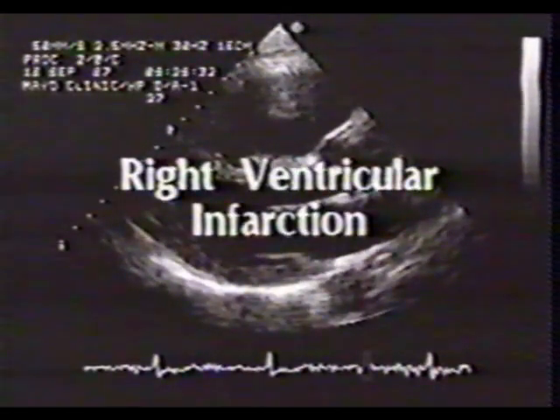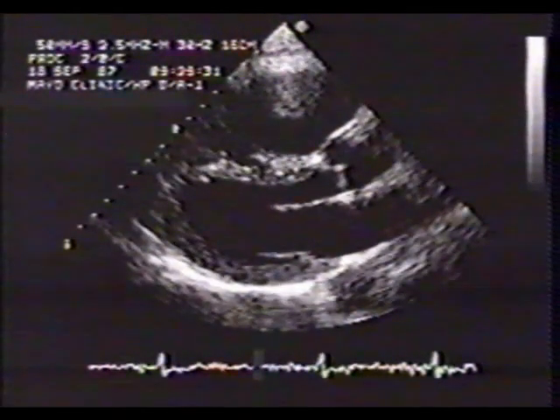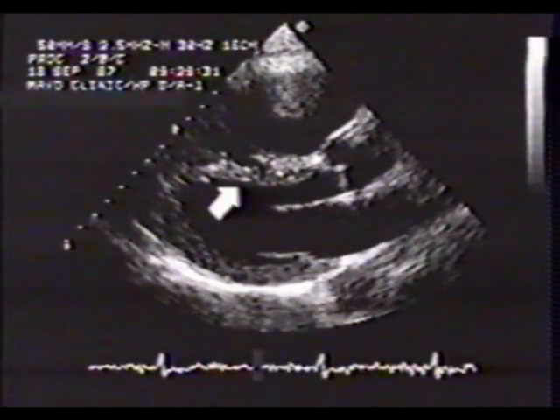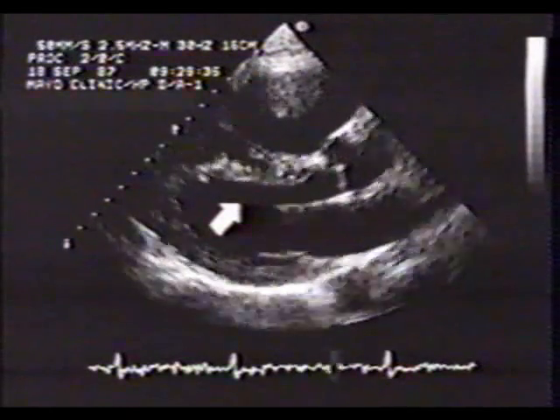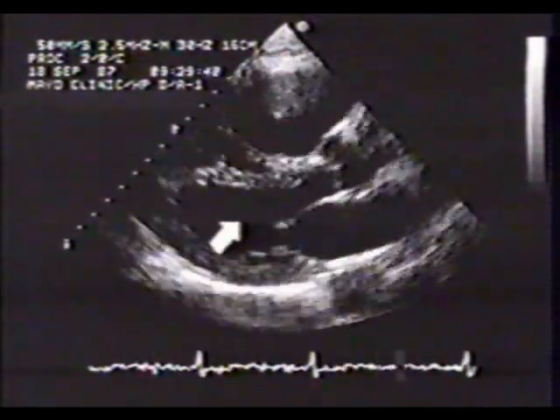This patient presented with an inferior infarct by ECG criteria. The right ventricle is enlarged. In real time, abnormal septal motion will be apparent. This is due to RV volume overload. Note the normal global LV function.